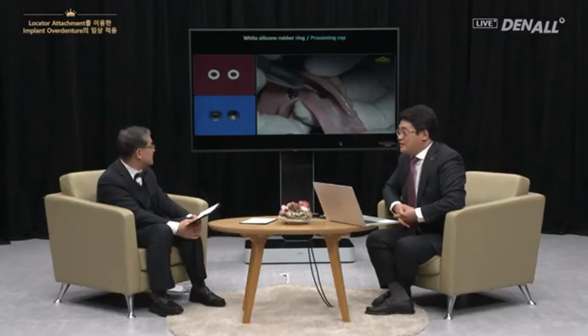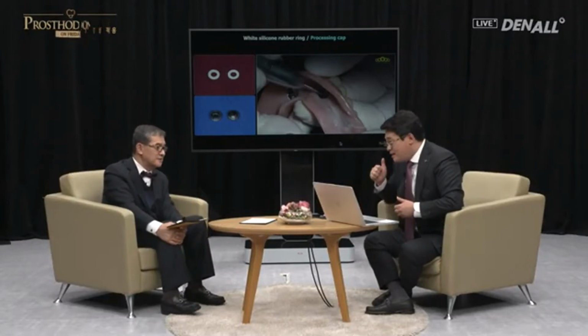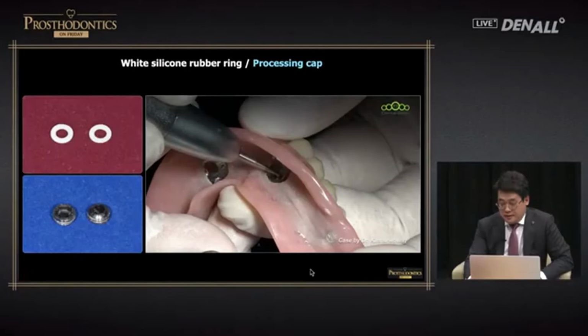The processing cap was in contact with a metal framework, and it was adjusted, and passive fit was gained. This is important to attach the processing cap.